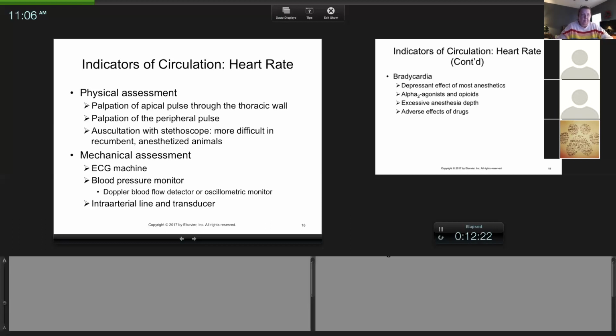And let me say that there's a lot of times where the heart rate's low, but probably one of my favorite doctors I work with, my criticalist, I had a low heart rate. I was kind of starting to think, oh my gosh, why is this heart rate so low? And he was like, what's your pulse ox? What's your blood pressure? And all those values were good. And the color was good. Pulse quality was fine. And he goes, if all of those are good, why are you worried about the heart rate?